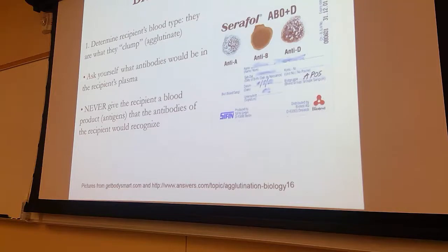Okay, so I know she's not blood type B. So you must be blood type O. Okay, one more. Whole bunch of anti-RH. Squirt. Does she live? Yes. So you're O negative? No, I'm not. Oh, so she doesn't live, right?